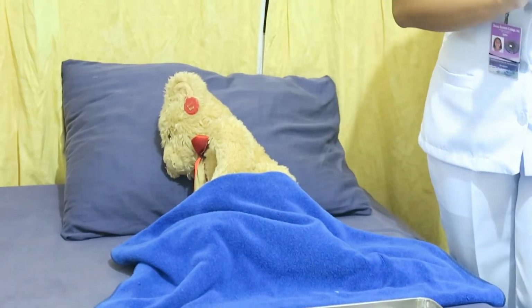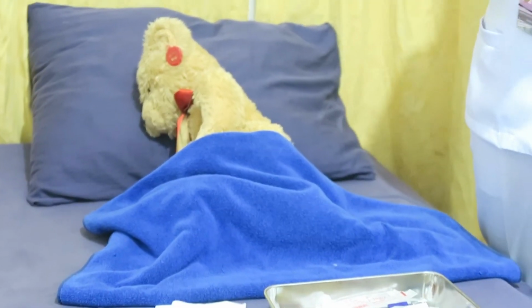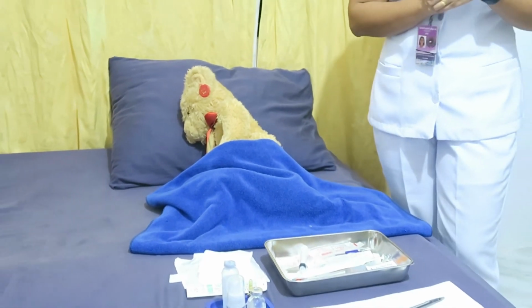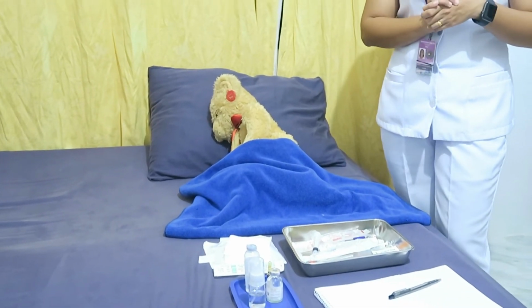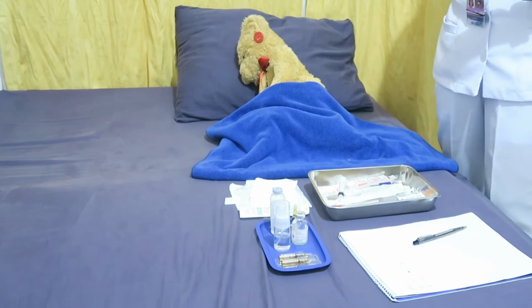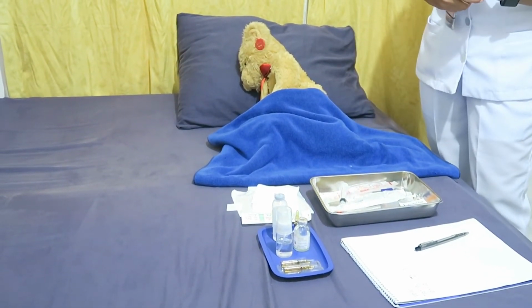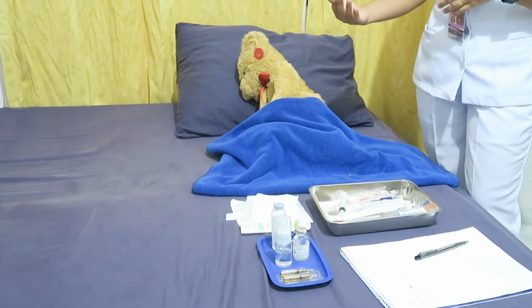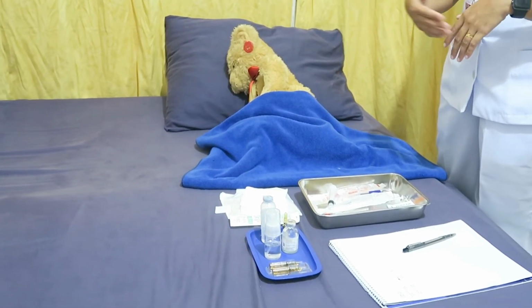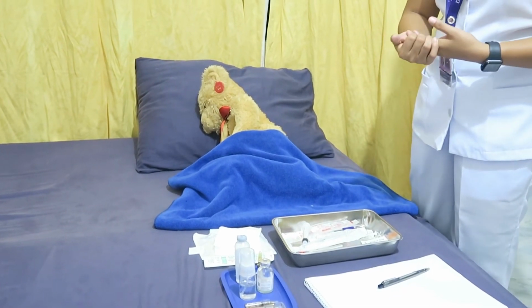And then, after that, select a site free of skin lesions, tenderness, swelling, hardness, or localized inflammation, and one that has not been used frequently. So next is, if injections are to be frequent, alternate sites, avoid using the same site twice in a row. So the next procedure is to locate the exact site for the injection.